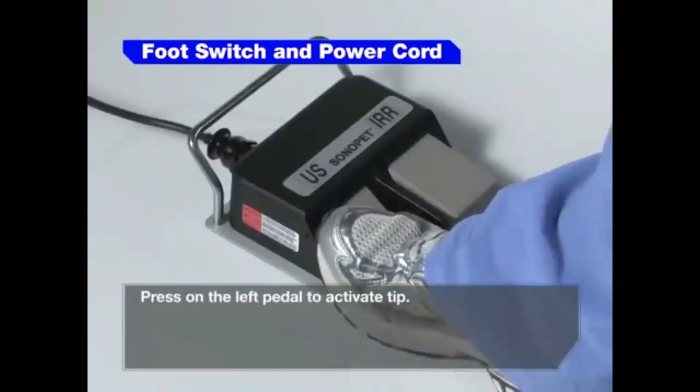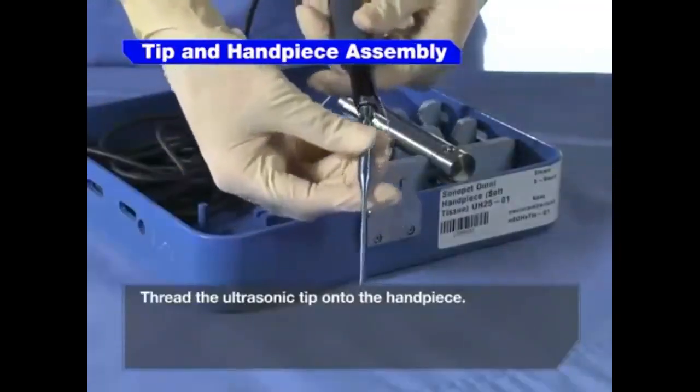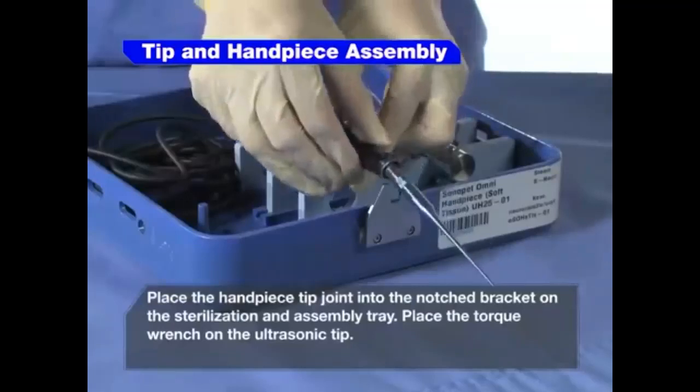Press on the left pedal to activate the tip. Thread the ultrasonic tip onto the handpiece. Place the handpiece tip joint into the notched bracket on the sterilization and assembly tray.